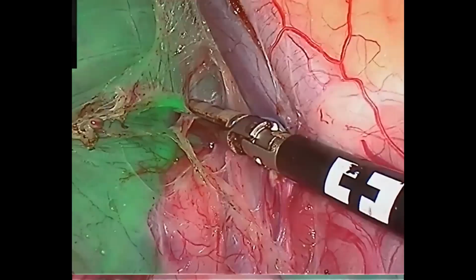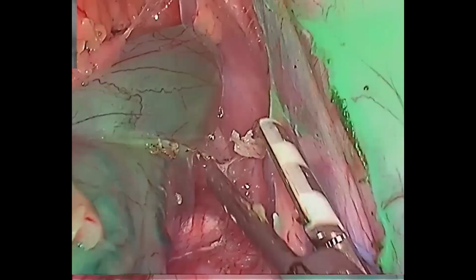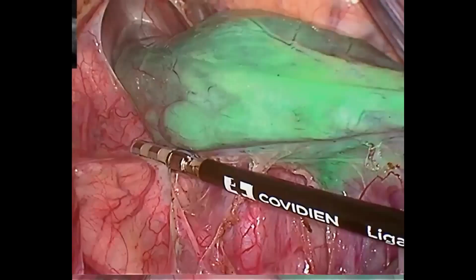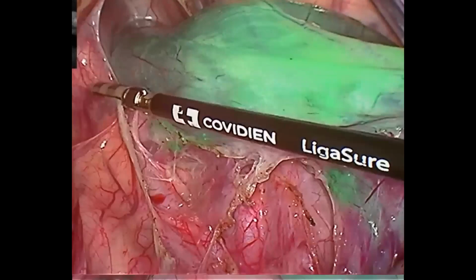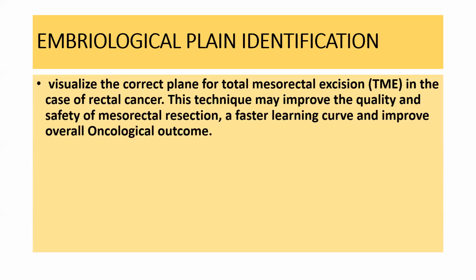So that is how the embryological planes can be tackled with the help of ICG dye, in a better way without any complications. That is how the lateral lymph nodes also can be tackled with the help of this. So embryological plane identification is possible with the help of ICG.